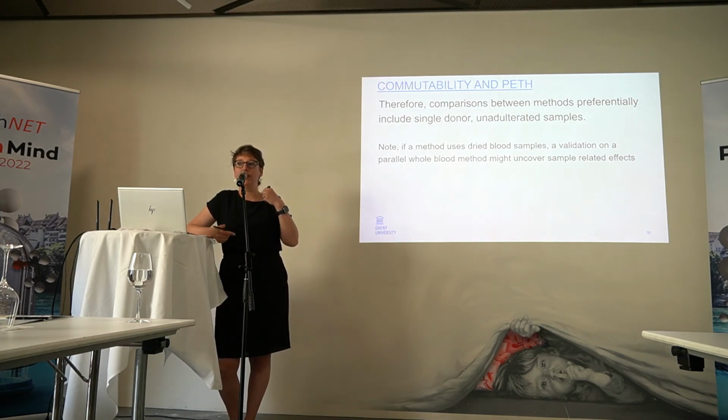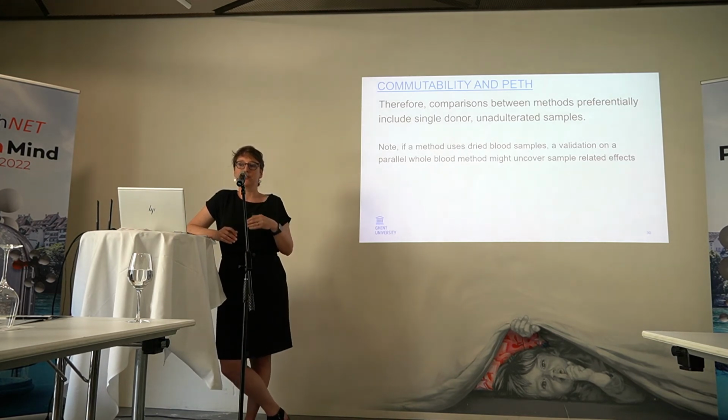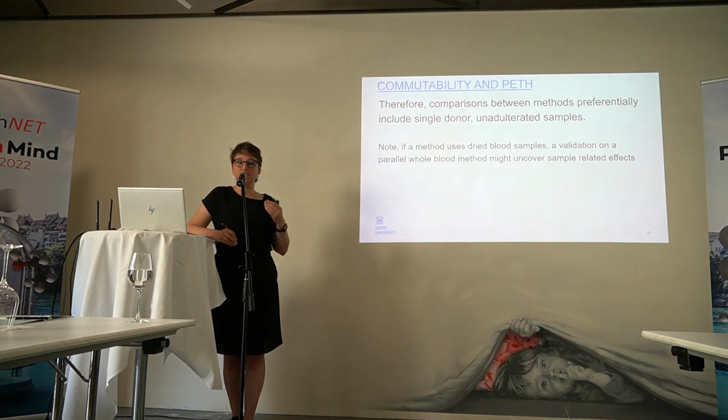And if you compare methods which have maybe a different measurement principle in terms of sample prep, you should make sure that the sample you use is delivered in a form that is useful for both methods. So the use of these non-pooled single donor native samples is very important to get a good understanding of how comparable methods are.